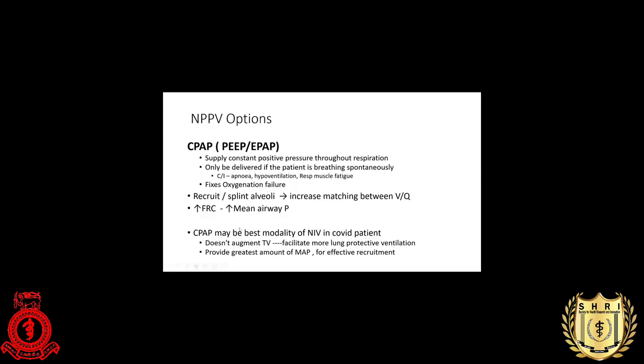So it is said that CPAP may be the best modality of NIV in COVID patients. How did it become the best modality? Because it does not augment the patient's tidal volume, so that will facilitate more lung protective ventilation. And it also provides the greatest amount of alveolar pressure when compared with BiPAP. So it was helpful in effective recruitment.